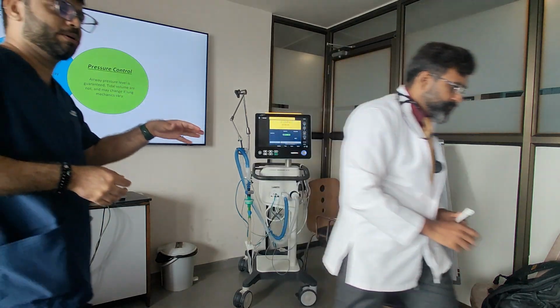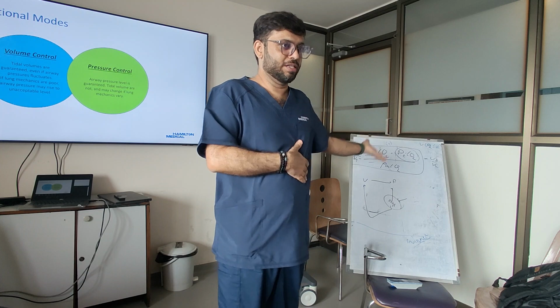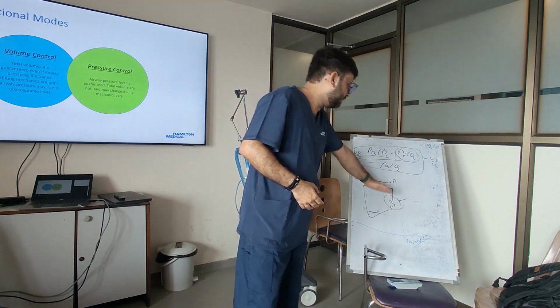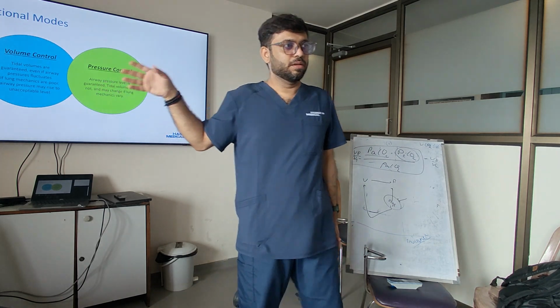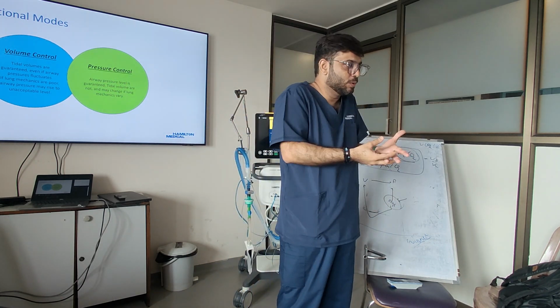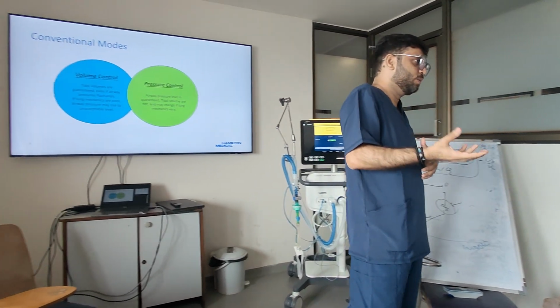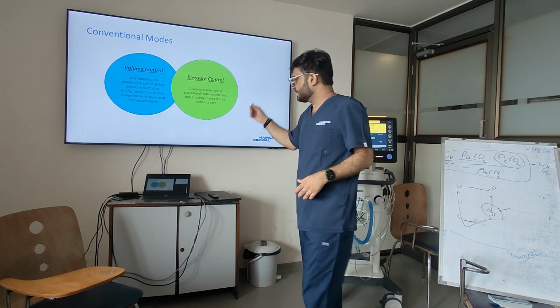Of course, there is a loop, but it is called an open loop, because it is we, the clinicians, who control this, as per the patient's condition. ASV is also not a completely closed loop, because what is completely closed loop is the intelligent mode. Now we know the conventional modes.